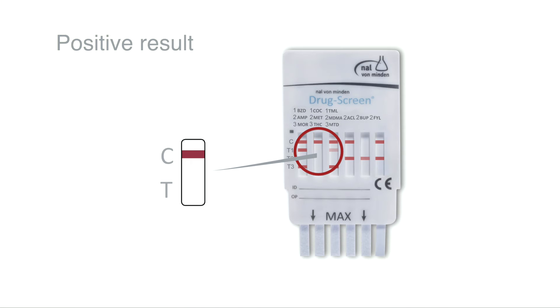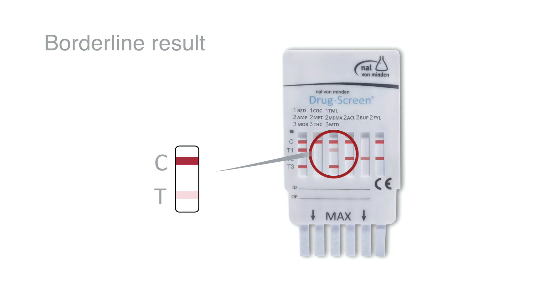The colour intensity of the test lines may vary between the different parameters or drugs. Only the complete absence of a test line should be interpreted as a positive result. Near cut-off concentrations can lead to weak test line intensities.